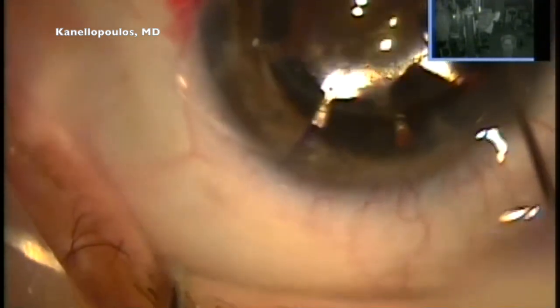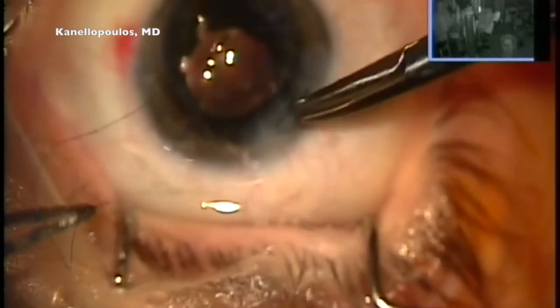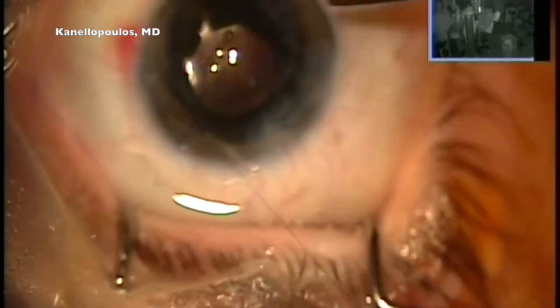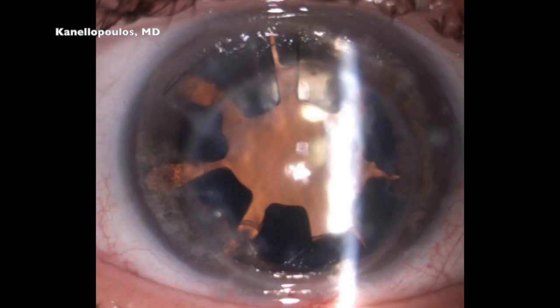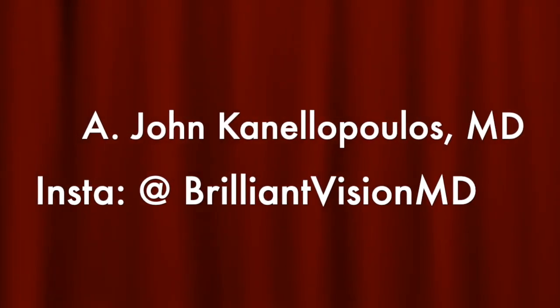In summary, this was a challenging phacoemulsification case. I'm placing a mattress 10-0 nylon suture here since I enlarged the incision, to ensure there'll be no leakage. This is the first day post-op — we went from hand motion vision to 20/50 minus: an excellent result. Hope you found this presentation interesting. This is John Kanellopoulos from Athens, signing out. Thanks so much.